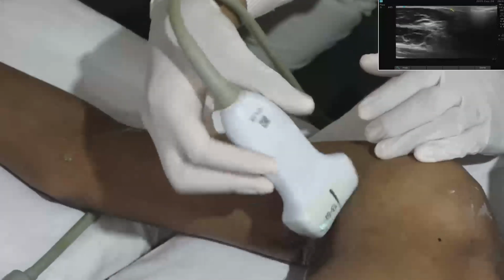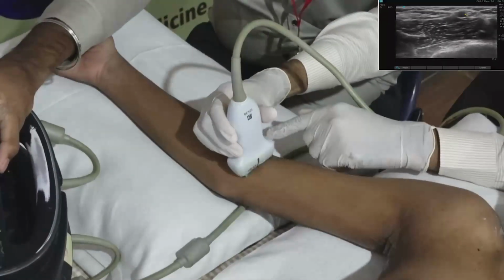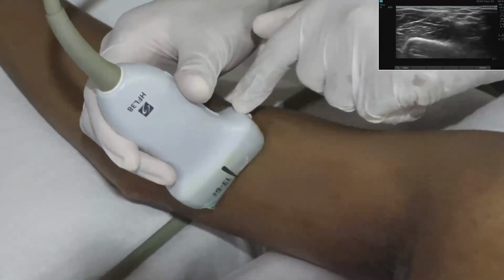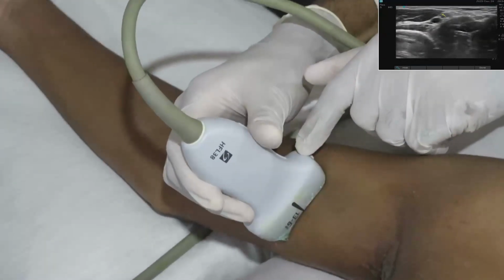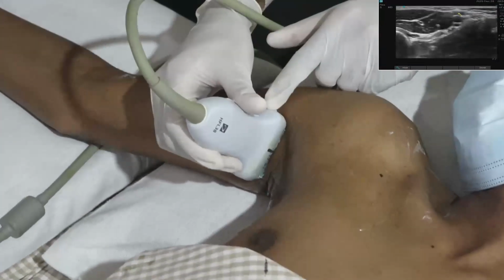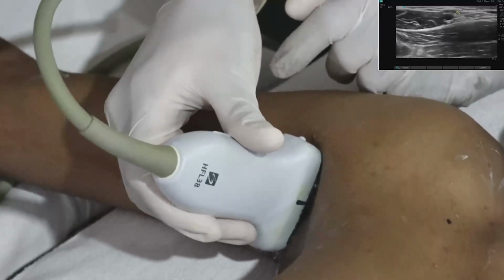Again, one second, I will trace from now. My marker is towards my side, that is the lateral side. So this is the median nerve now. If we trace the median nerve, it is almost lying over the 12 o'clock position, and we can easily identify it.